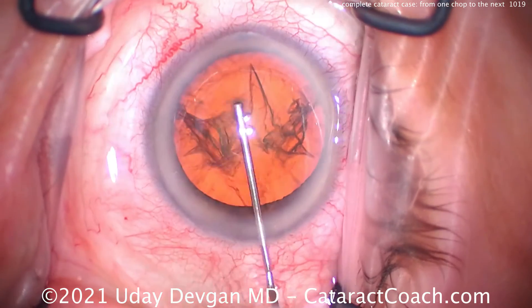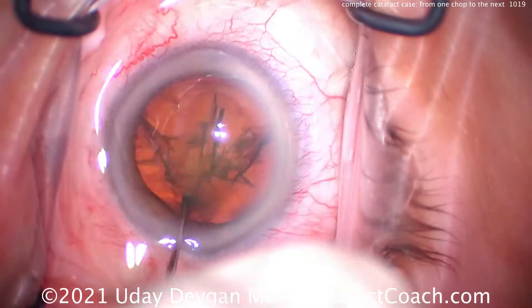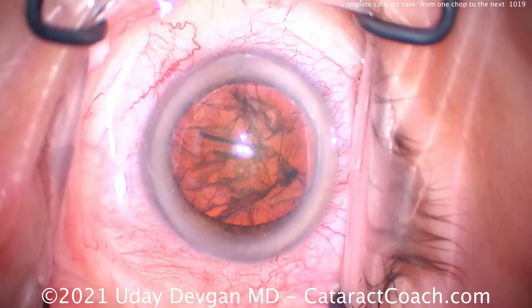So hydrodissection, of course, for the good chop — and to be able to rotate this thing, let's make sure we have good hydrodissection. There's the good rotation.